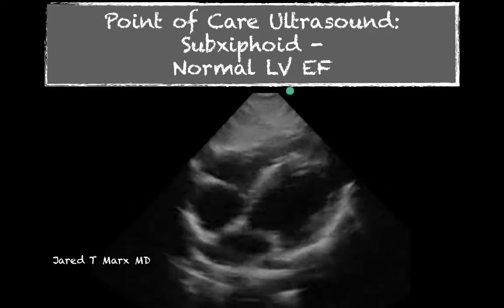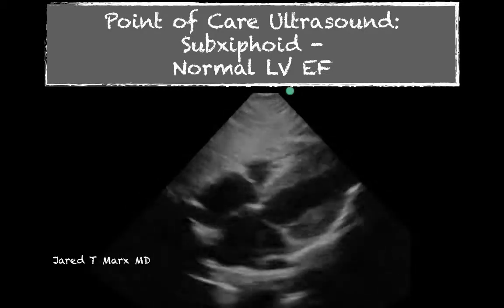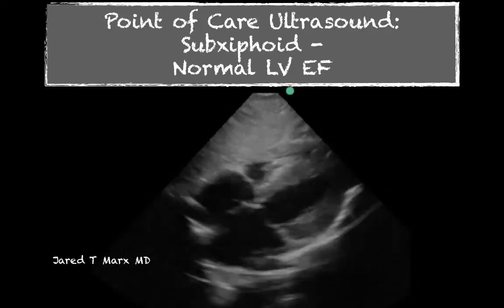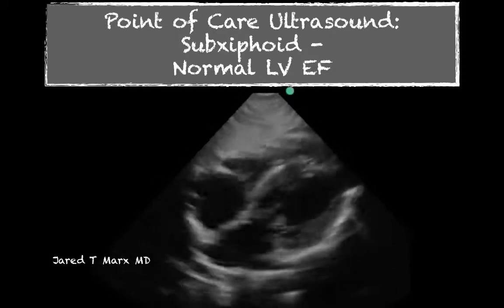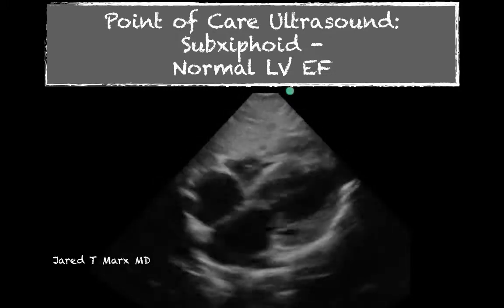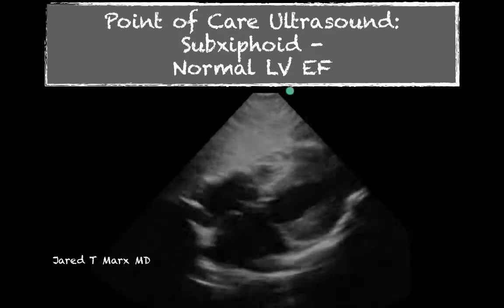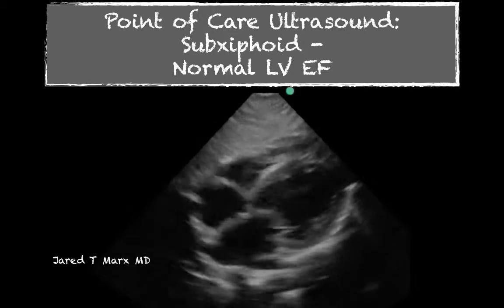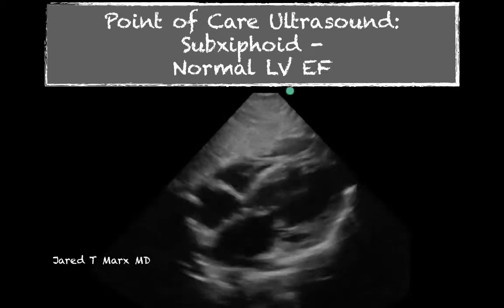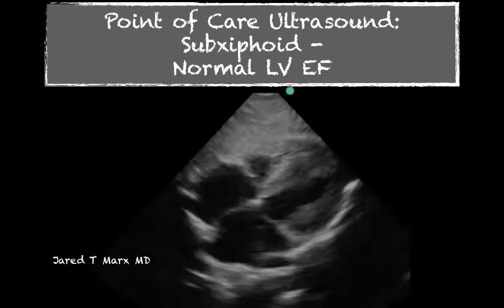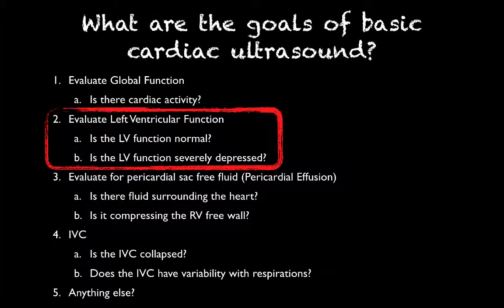Welcome back. We're going to take a look at the subxiphoid view on the cardiac exam. This is also a part that you could see on your FAST exam. We're going to look at three examples of a normal ejection fraction to review our binary questions, and in this case we're going to only look at the left ventricular function so that we can appreciate whether it is normal or not.